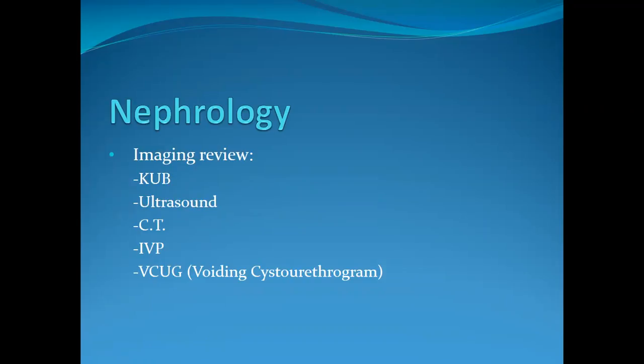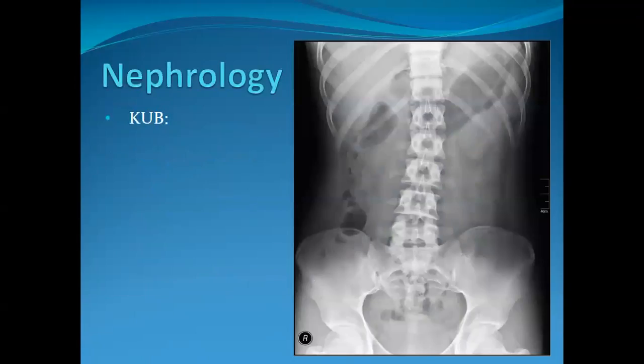We're also going to talk about some nuclear imaging of the kidney, which is not on there, the Lasix renogram. That's going to be toward the end of the lecture, but it's going to be a good lecture to give you a foundation of how we image the kidneys and some advantages of the different types of imaging.